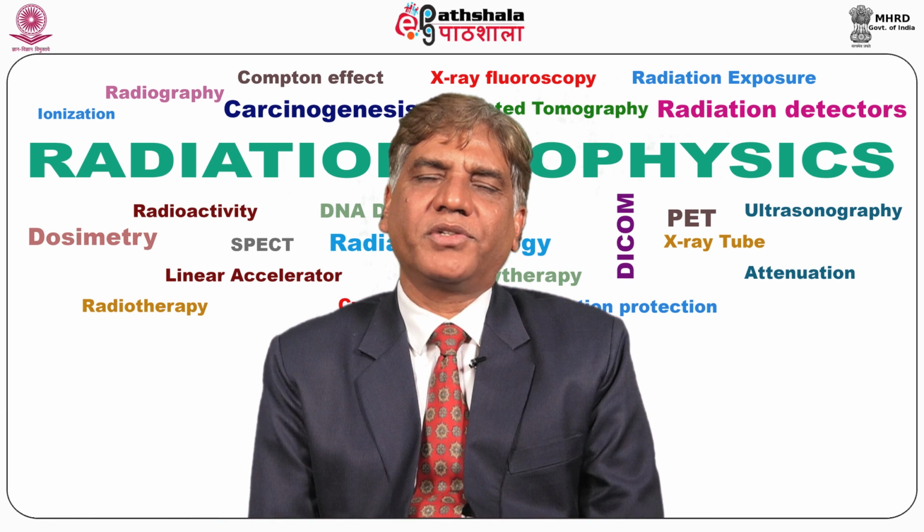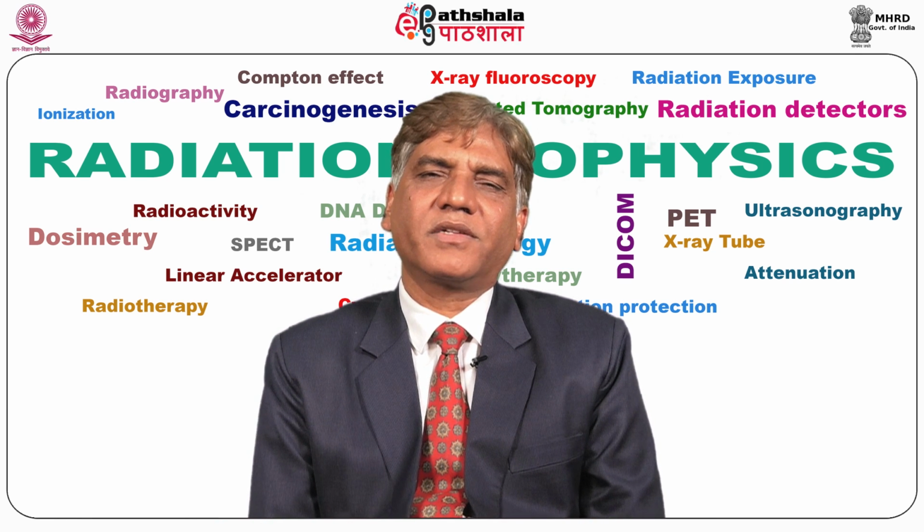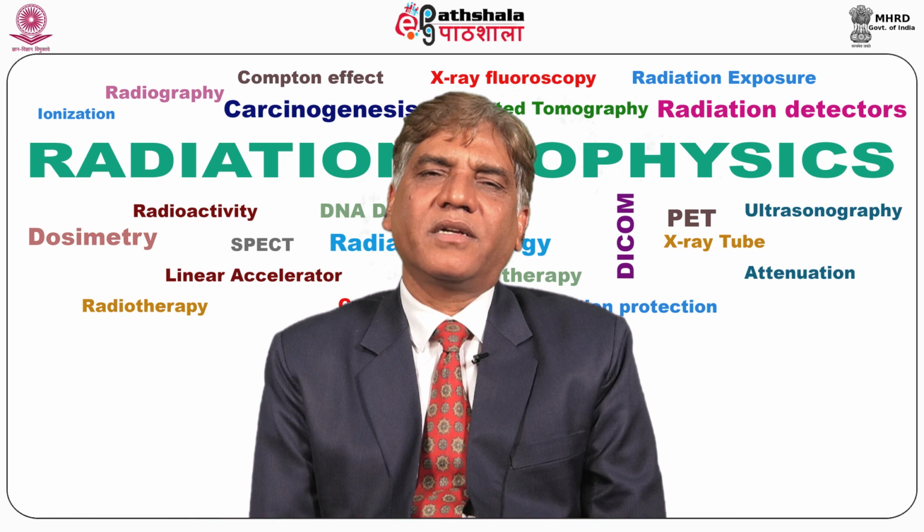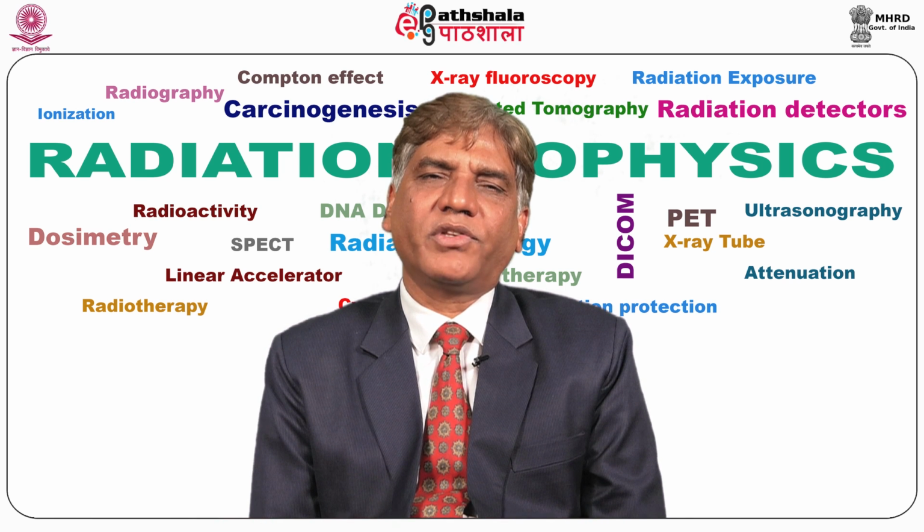After exposure termination, TFT array activation occurs, turning on the gate lines, and the accumulated charge in the capacitor flows through the transistor to the drain line using multiplexers, and subsequently to a connected charge amplifier, where voltage conversion and digitization take place. Voltage is then converted back into a grayscale value at the display stage.